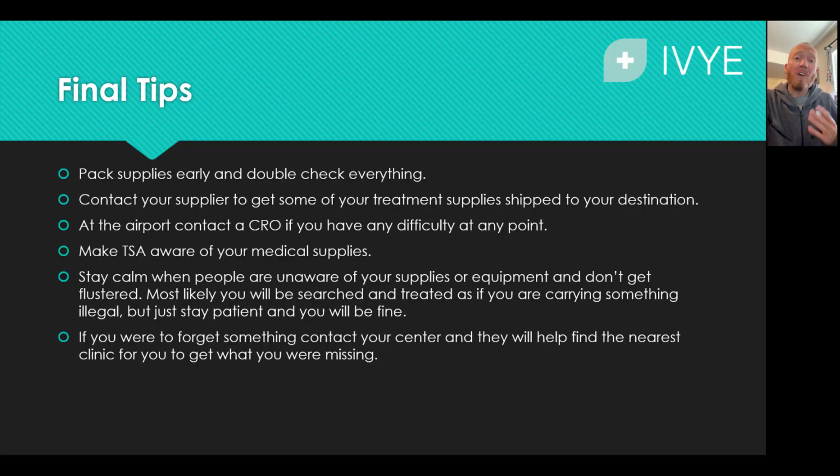Okay, I'm just going to go over some final tips for everyone, and I hope you enjoyed today's video and that you found it informative and that it will help you take your next or very first trip with your dialysis machine. Pack supplies early and double check everything. Contact your supplier to get some of your treatment supplies shipped to your destination. At the airport, contact a CRO if you have any difficulty at any point. Make TSA aware of your medical supplies. Stay calm when people are unaware of your supplies or equipment, and don't get flustered.